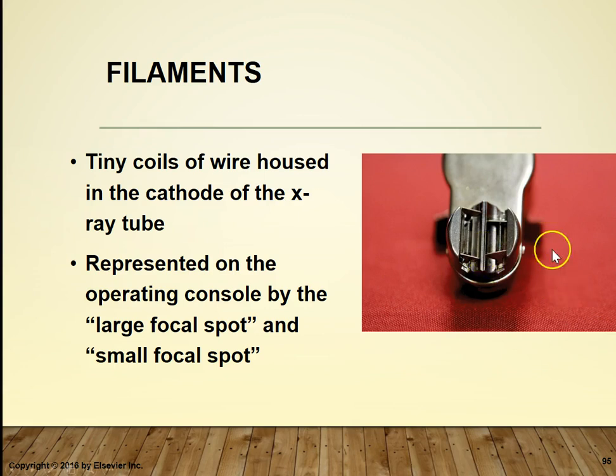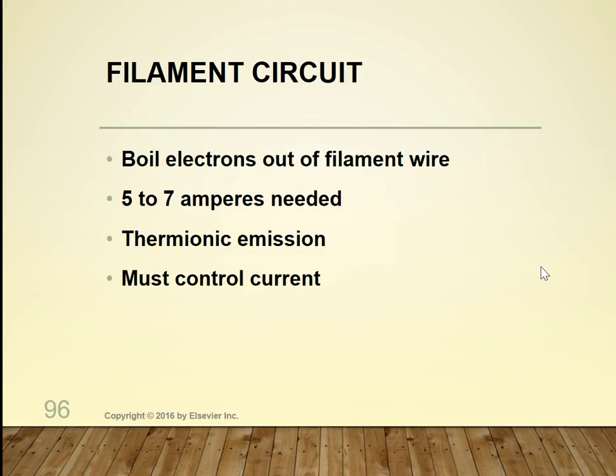So seeing these up close and personal, and these are magnified, there's our large focal spot and there's our small. See this difference in sizes right there. So that's the whole point of the filament circuit. The goal of the filament circuit is to literally boil electrons out of the filament wire.